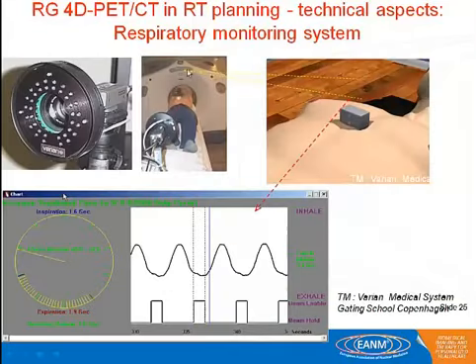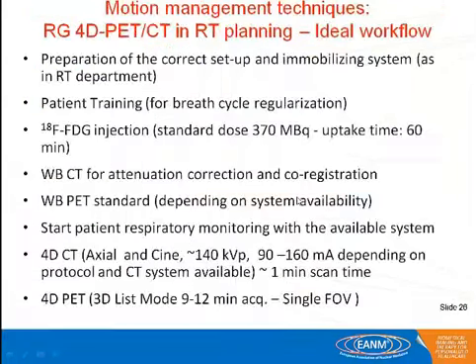Here I show how it works. You see the camera, the box of the patient, and also you see how it was like before the respiration. This was taken from Copenhagen, but it's the same, we use the same positioning. So I use the workflow: preparation and setup, immobilizing system as in the radiation therapy department, patient training, injection, whole body CT for attenuation correction and co-registration, PET standard.